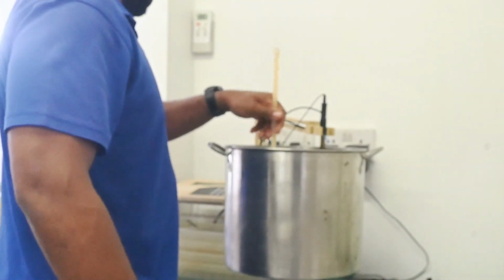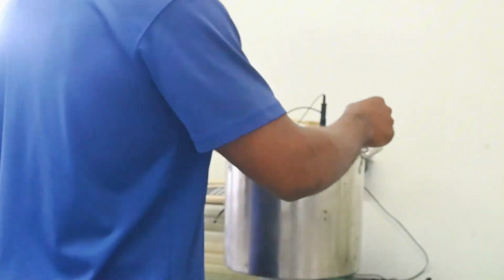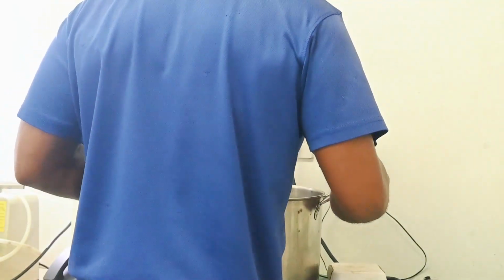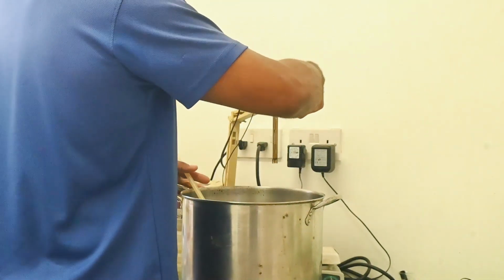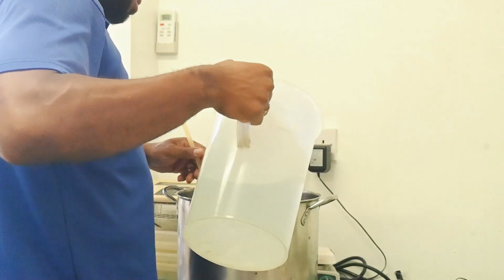When the temperature has reached 25 degrees Celsius, we switch it off and we remove the pan from the heating plate. And then we have to bring the volume up to 16 liters.